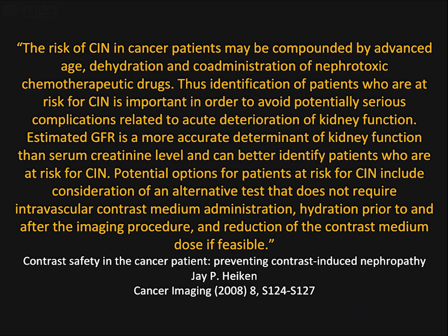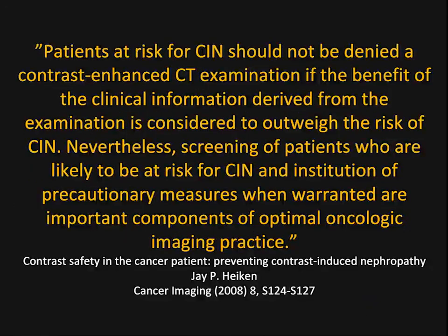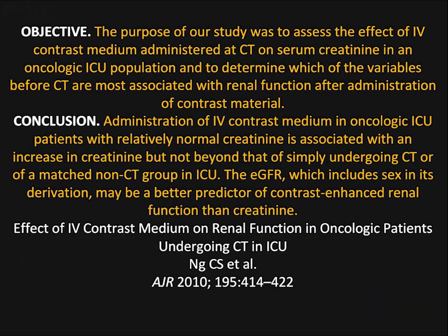Potential options for patients at risk for CIN include alternative studies that don't require IV contrast, hydration pre- and post-study, and the reduction of contrast volumes. Jay is also very clear to say patients at risk for CIN should not be denied a CT scan with contrast if the benefit of the study outweighs the potential risk of the study. And that's something we always know. Everything is a risk-reward. As long as the study gives you critical information, it's typically worth the risk.